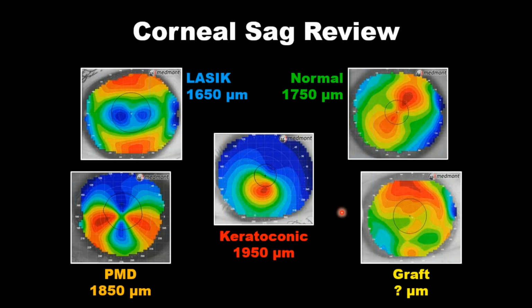But the takeaway message is that we need various sagittal depths because the surgical procedures and a vast majority of the disease affect the cornea. Now, do they affect the sclera? And does that change how we approach the landing and the limbal clearance?